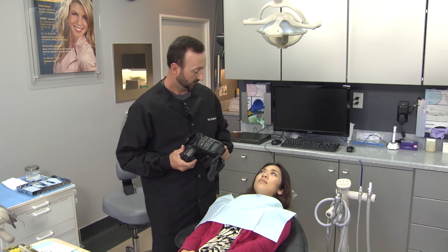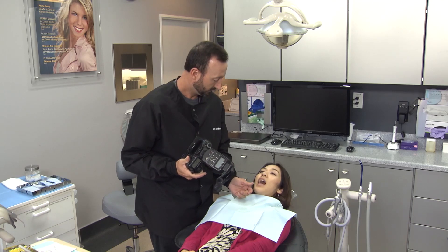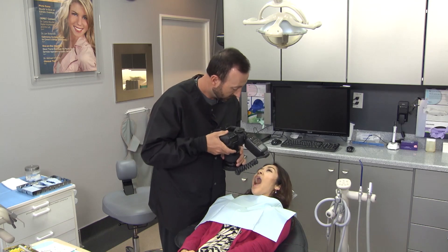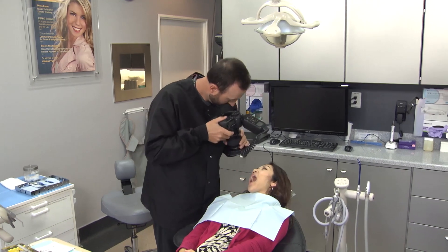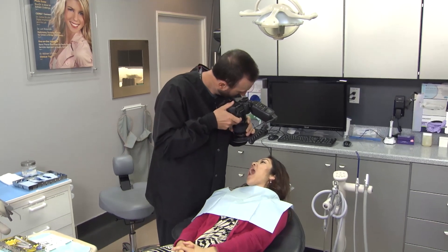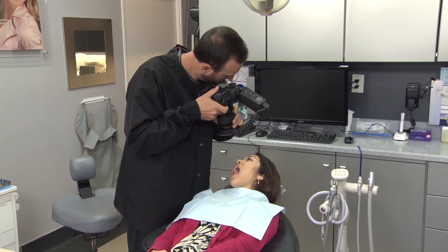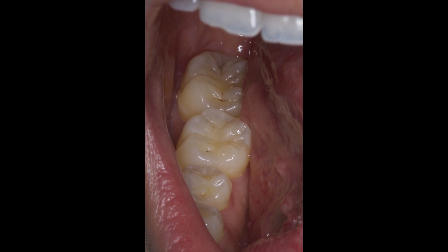Take for example this attempt to capture an occlusal photo of tooth number 30 with no retraction or mirror reflection. Besides the need to go through additional motions to set the patient's head and neck in position, the resulting image simply isn't a great way to communicate anything to the lab. Shade, shape, design features, or even remake ideas cannot be easily communicated with this method.